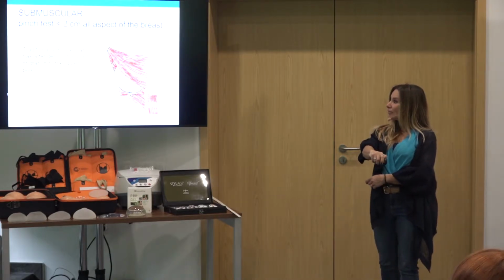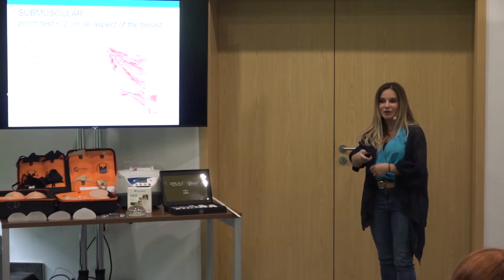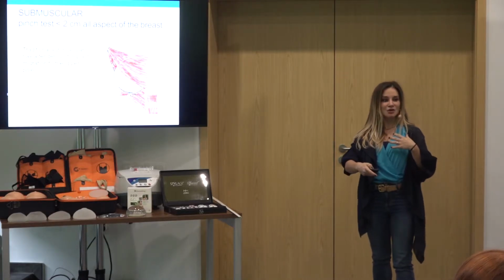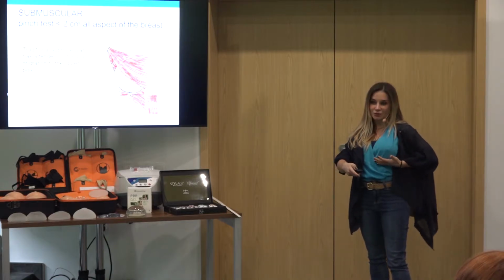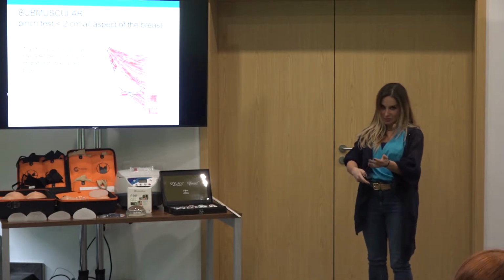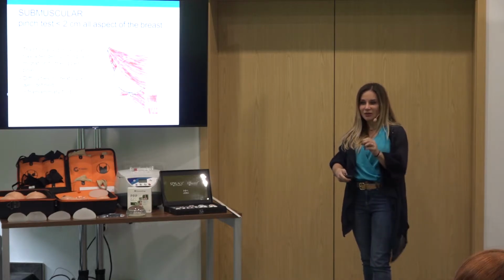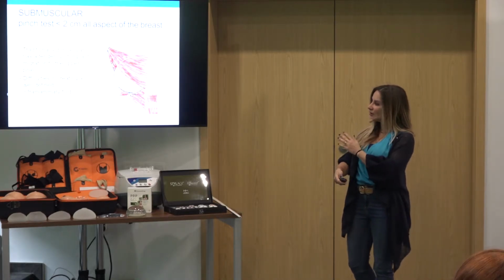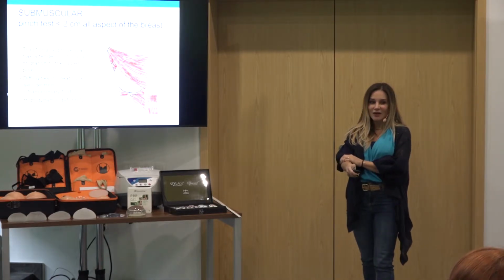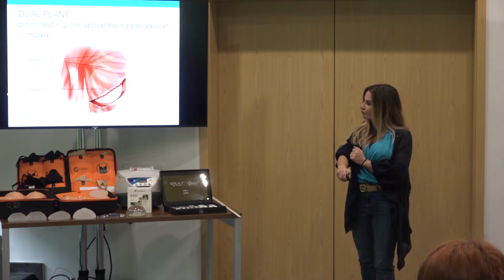And for that reason, we have a tendency in some patients, in some types of surgery, for the breast implant to migrate a little bit upwards. So we have a major fullness in the upper part compared to the lower. This is one of the side effects of the regular complete submuscular, especially when we do not define in a special and particular way the submammary fold. So we do not have a very good and well-defined inframammary fold. And for those patients, we have a very high incidence of breast deformity.